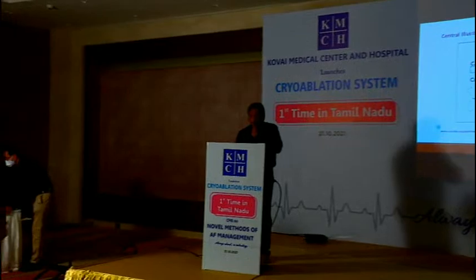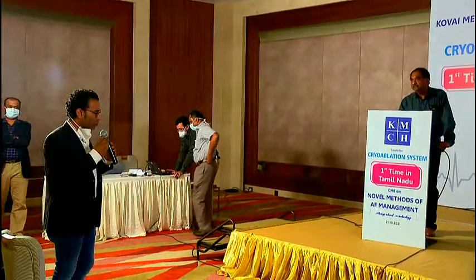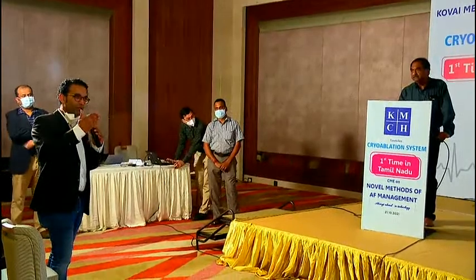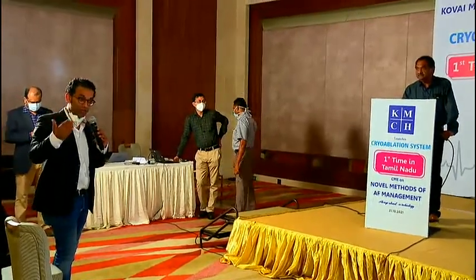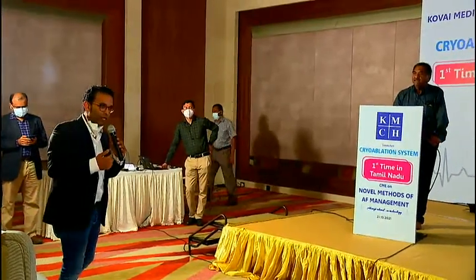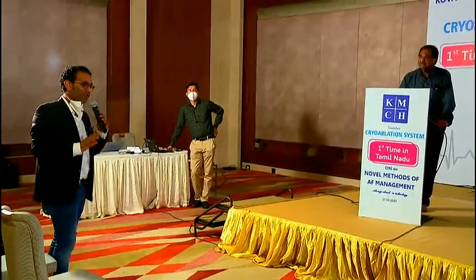Smartwatches are an excellent tool, and the newest technology on smartwatches already gives such a good quality ECG that you can nicely differentiate the distinct P waves. So you can nicely see, is it an atrial tachycardia, is it flutter, is it atrial fibrillation? It's not like a couple of years ago where we just looked, okay, there are QRS complexes, they're irregular, should be AF. But time has changed, and I think this is honestly the future.